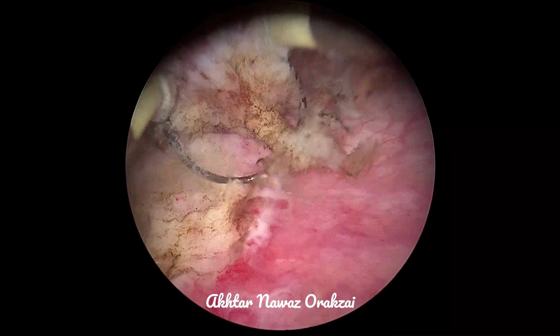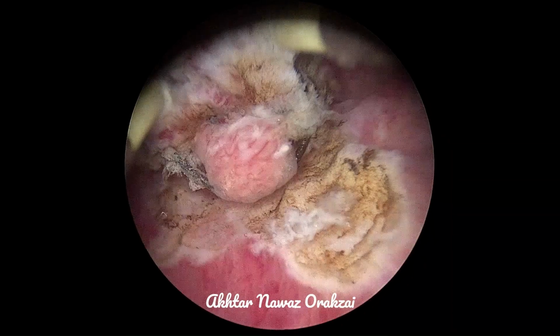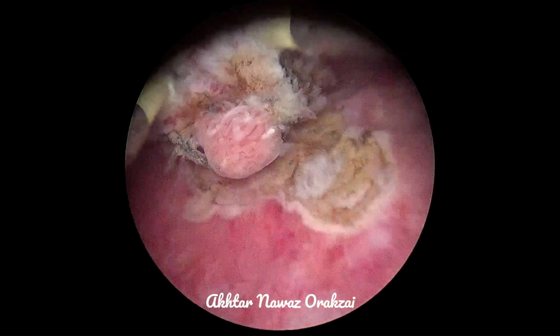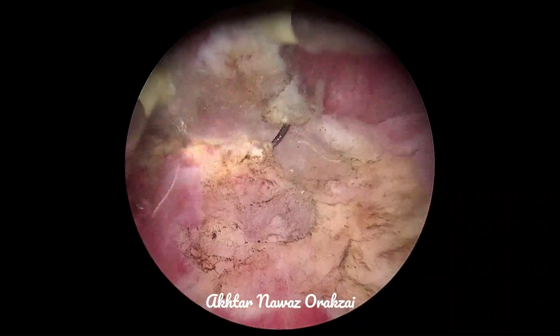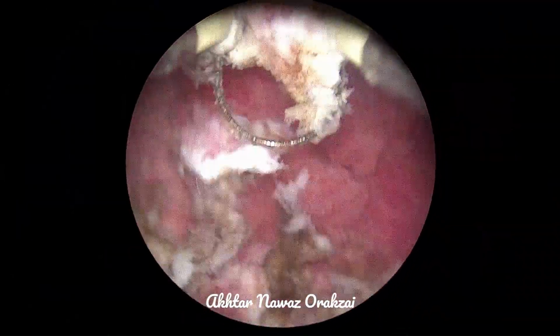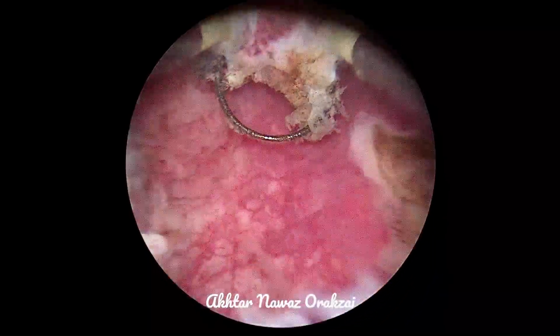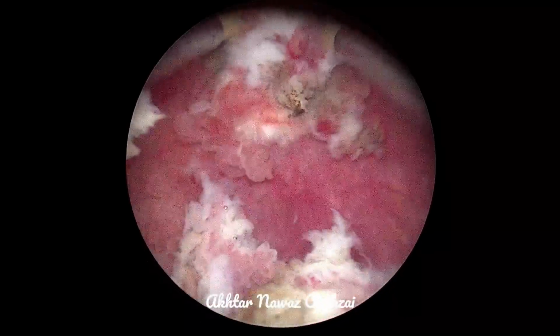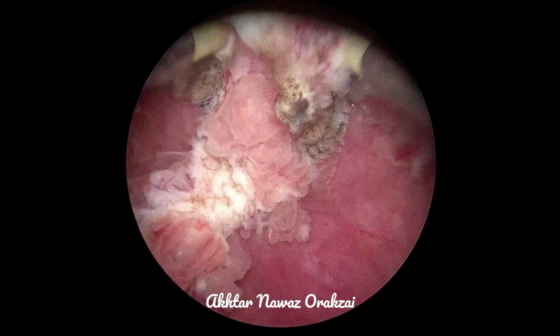The patient was given general anesthesia because he was young, and the location of tumors on the ultrasound were such that obturator jerk was expected, so general anesthesia was given. So we have resected one mass. Now is the resection of the other masses.